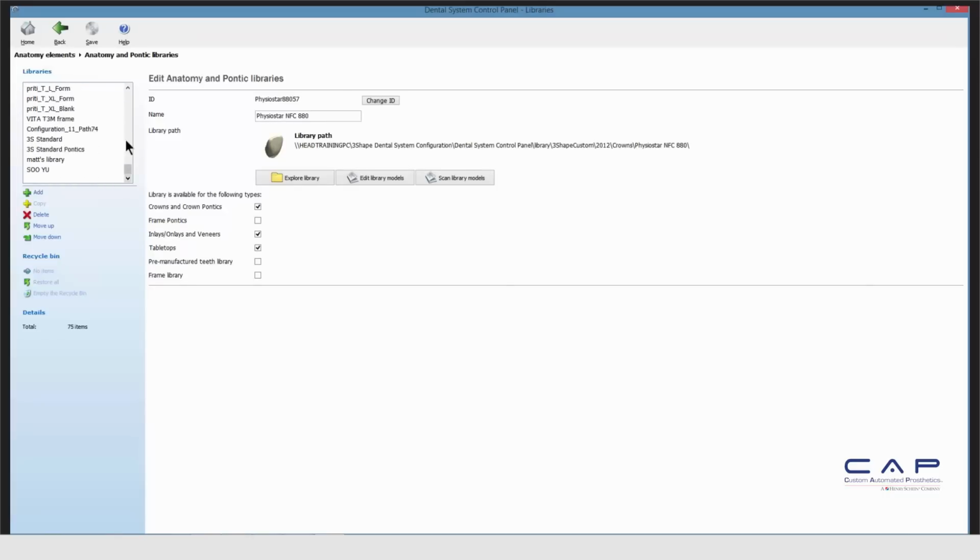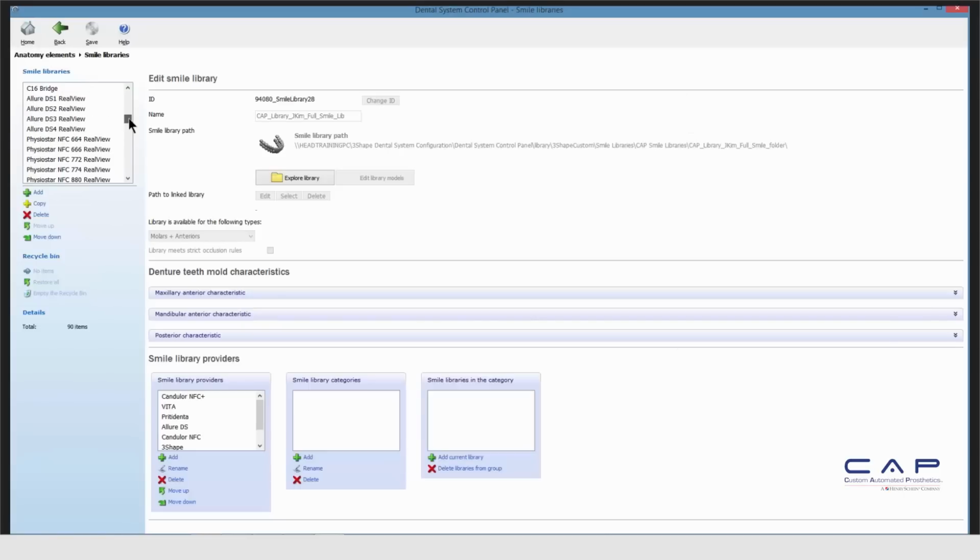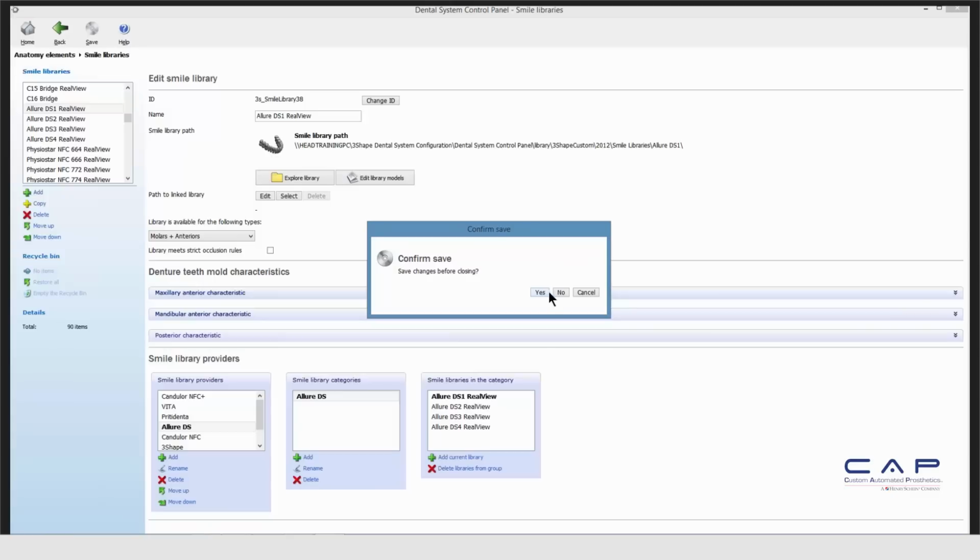The thing is, I know for a fact both companies are adding more and more tooth libraries to their software. So over a period of time, I expect that most full dentures will be made via CAD CAM. All the teeth companies will be anxious to get these digitized. So you have Candulor, Allure. All those have different types of denture teeth that we're going to be using for these setups. If you try to use some of these denture teeth in your everyday designs, you'll notice you run into some issues where it won't be able to generate the STL. That's because they're specifically set up for denture design in 3Shape and not necessarily the everyday workflow teeth.